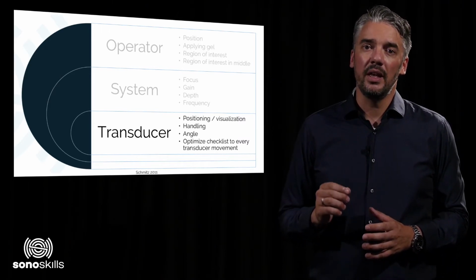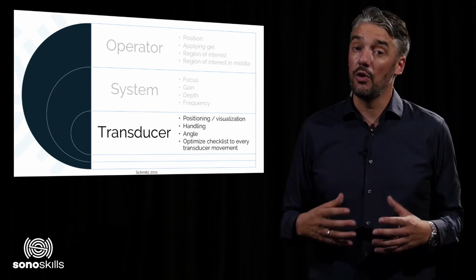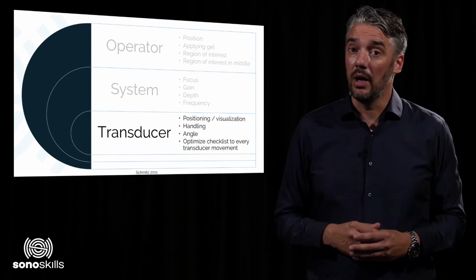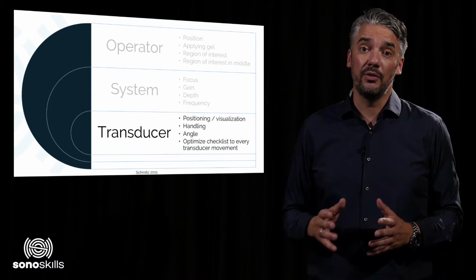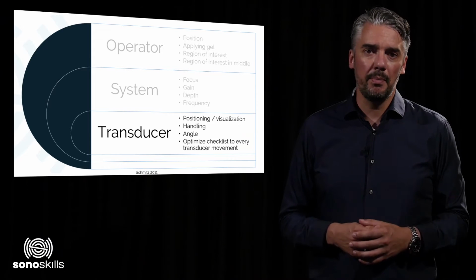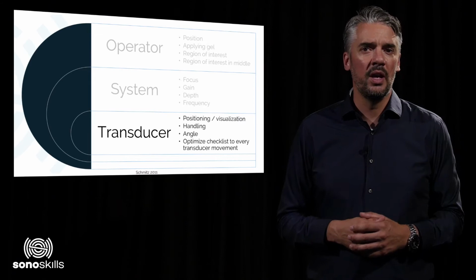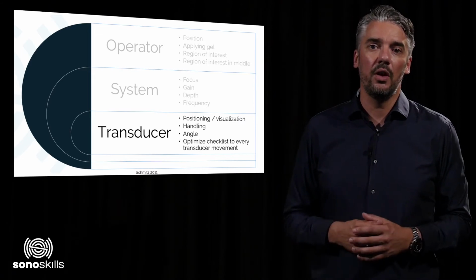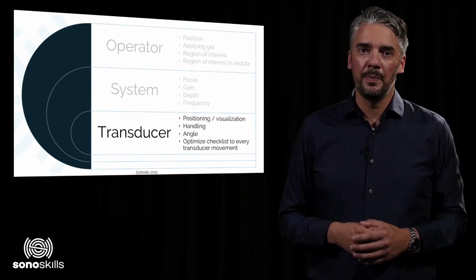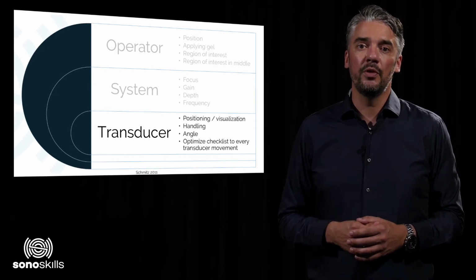There is generally less convention with respect to imaging structures transversely or in short axis. Some maintain the left side of the screen as the anatomic right, and others orientate the left of the screen as the medial aspect of the body. It is probably best to perform transverse or short axis live scanning in a position that makes sense with the orientation of the patient with respect to the screen. For example, when the transducer moves in the medial direction on the body, it should move the same direction on the screen.